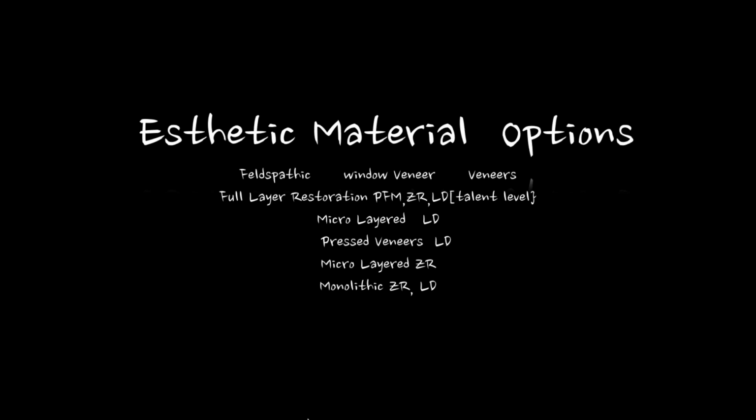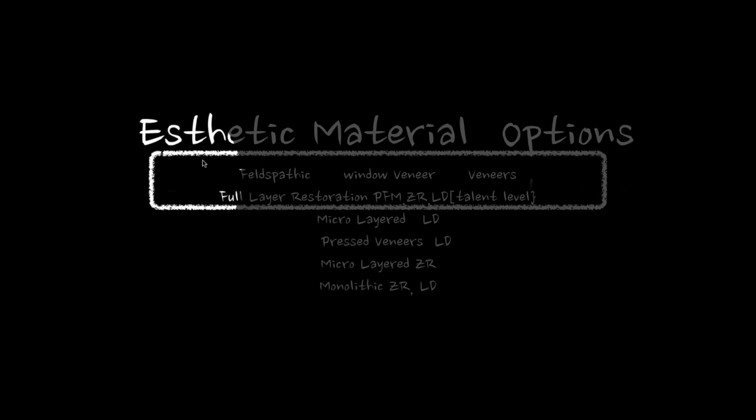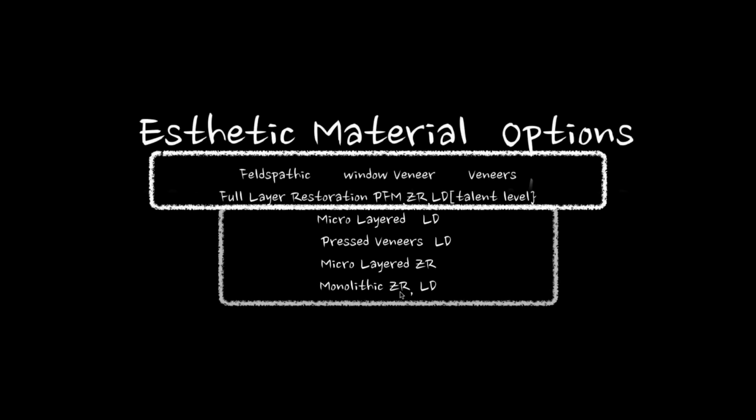The second after that becomes fully layered restoration, so whether it's metal ceramics, zirconia ceramic, lithium silicate ceramic. And then after that, the next level is the more common level that we're using today. I actually showed this in a lecture I did last Friday or Saturday with the Aegis group, but it was interesting because this area on the top here is where I want to live as much as possible, even though some of this is more full coverage. The bottom group is where our profession lives the most.